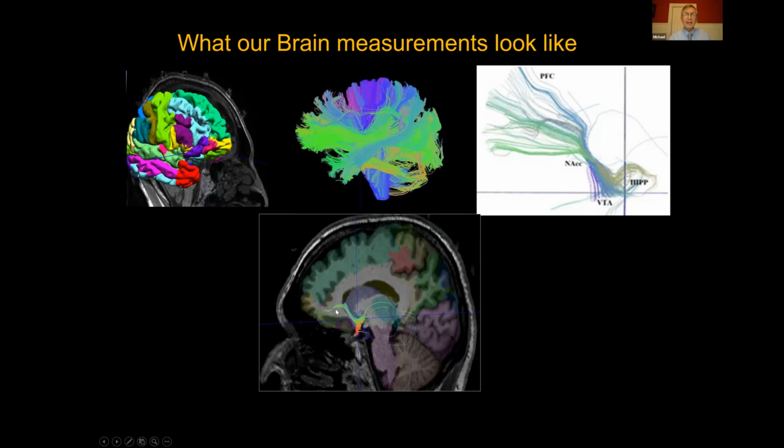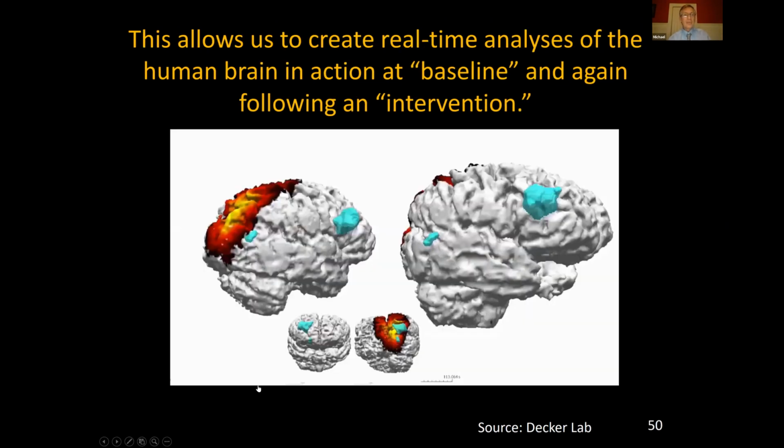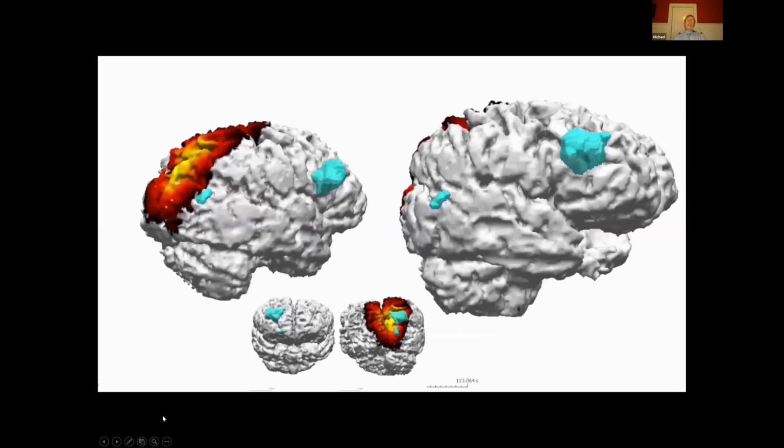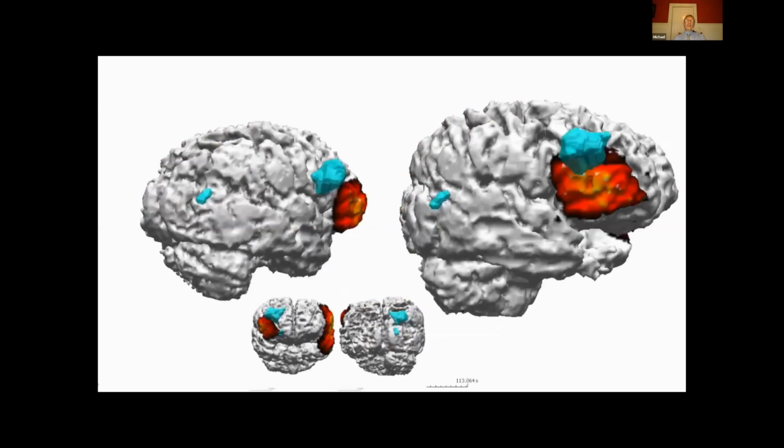So we're getting to that level of resolution in some of our imaging. This is just an image of the fMRI structural scan with the fMRI blue dots with the EEG lying over top of that as a person's laying in the scanner thinking. I don't know if the video would actually run. Oh, it does. So what you're seeing is the EEG transformed as the person's lying in the scanner thinking.